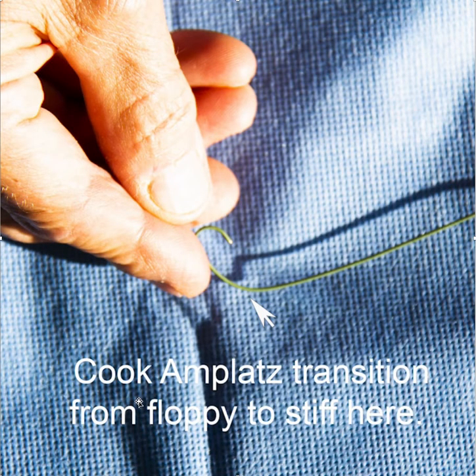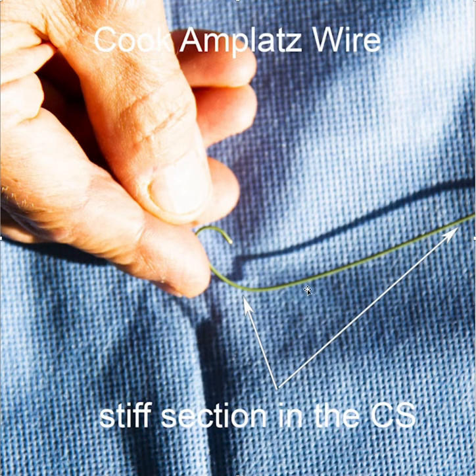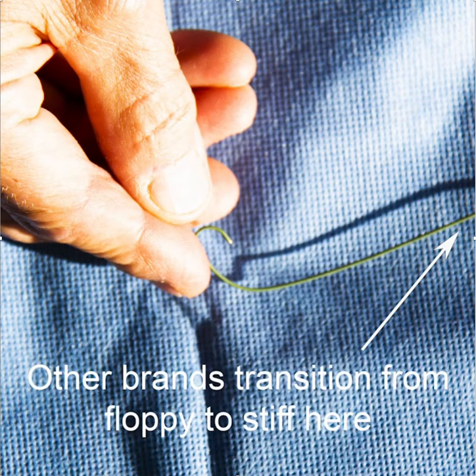You may ask, why are we using a Cook Amplatz wire? Why not just any Amplatz extra stiff wire? It turns out that the Cook Amplatz has what's called a short transition — a short taper. It goes from its floppy section to its stiff section relatively quickly. As a result, you get the stiff section into the coronary sinus when you put it through the vein selector.